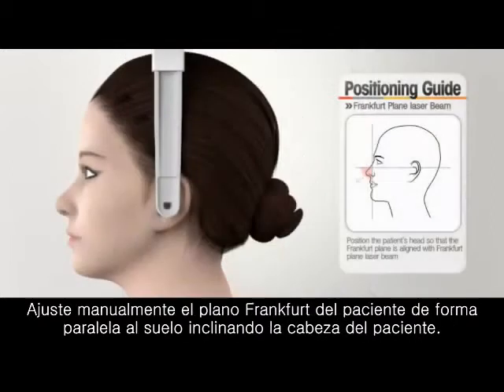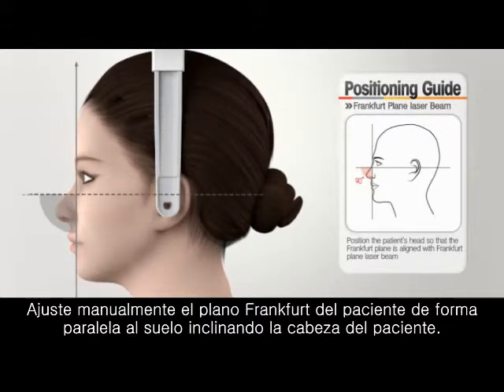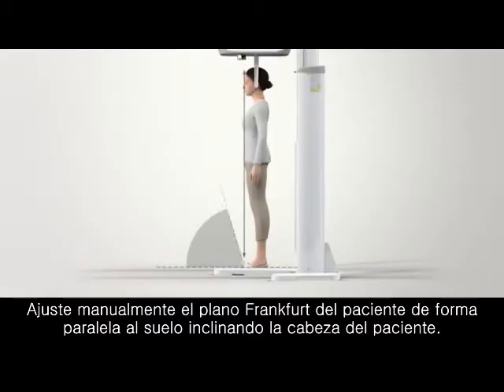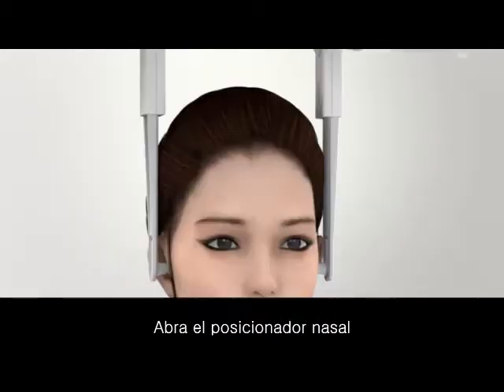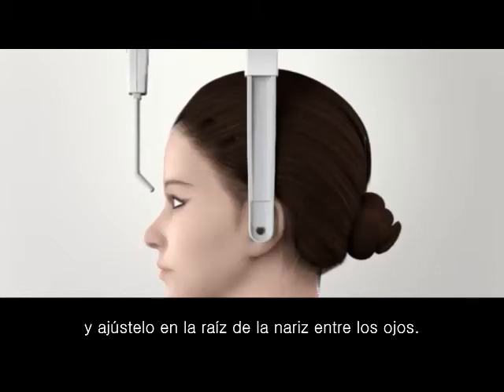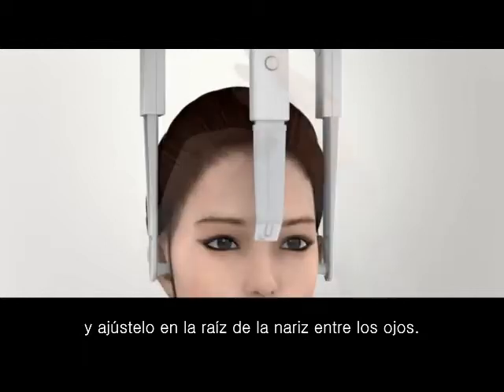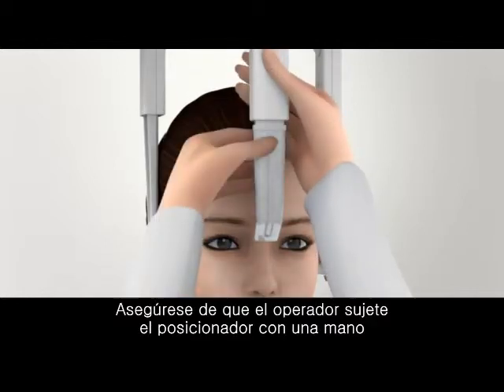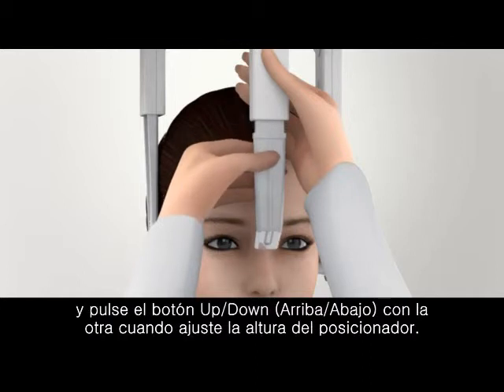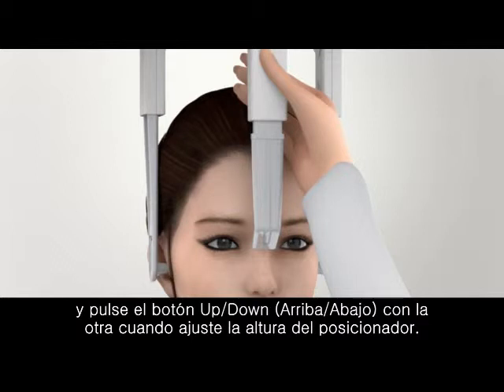Adjust the patient's Frankfurt plane at a level with the floor by manually tilting the patient's head. Unfold the nasal positioner down and set it at the root of the nose between the eyes. Make sure the operator keeps holding the positioner in one hand and presses the up-down button with the other hand when adjusting the height of the positioner.